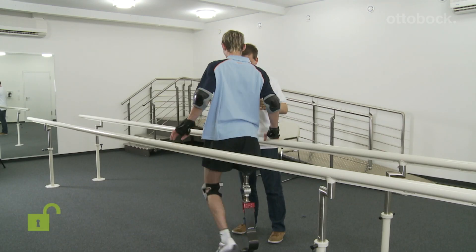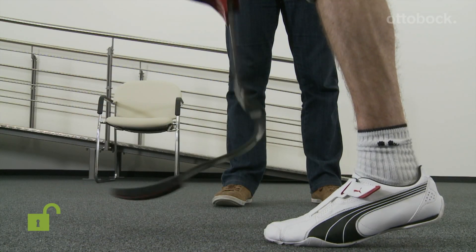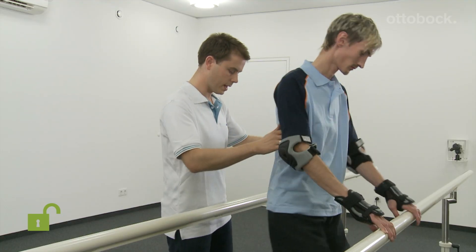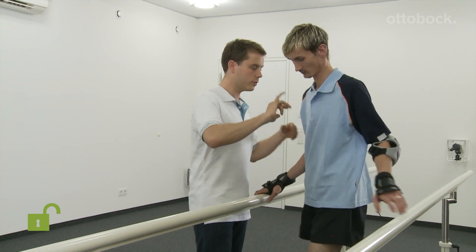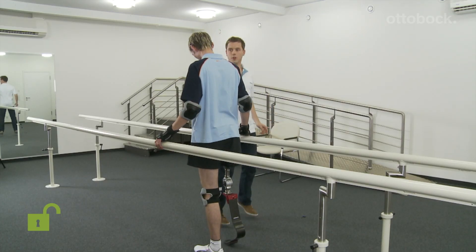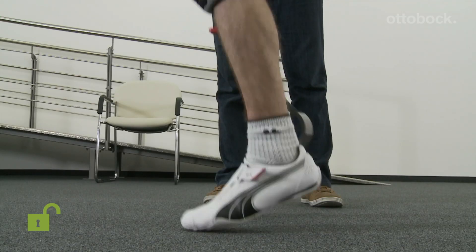In the next exercise, the user turns left and right around his own axis. He stands between parallel bars with the joint unlocked. It is necessary to ensure strong hip extension at all times. The rotations are now performed in both directions with jumps. These exercises serve to train prosthesis coordination.